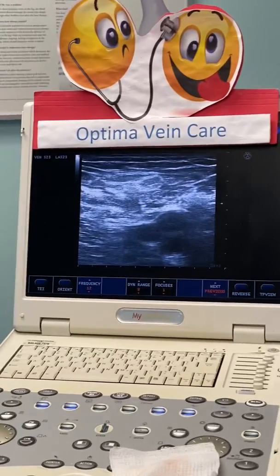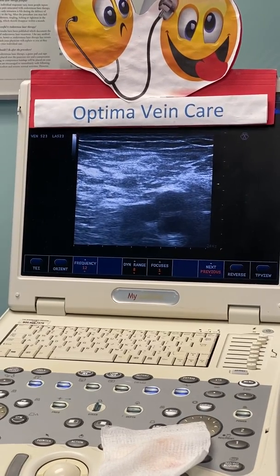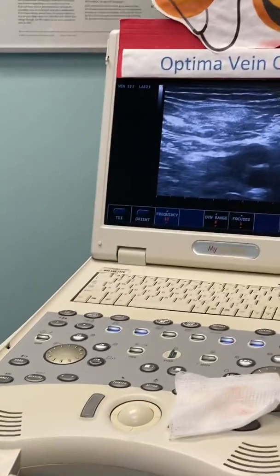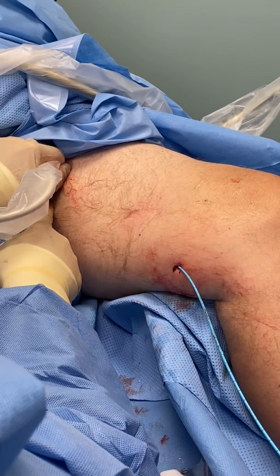This patient is going to have a new procedure called VenaSeal. It's a medical adhesive utilized to close the great saphenous vein. We've positioned the catheter at five centimeters from the saphenofemoral junction. We have our supply of glue in the injector and I'm compressing the saphenofemoral junction now.